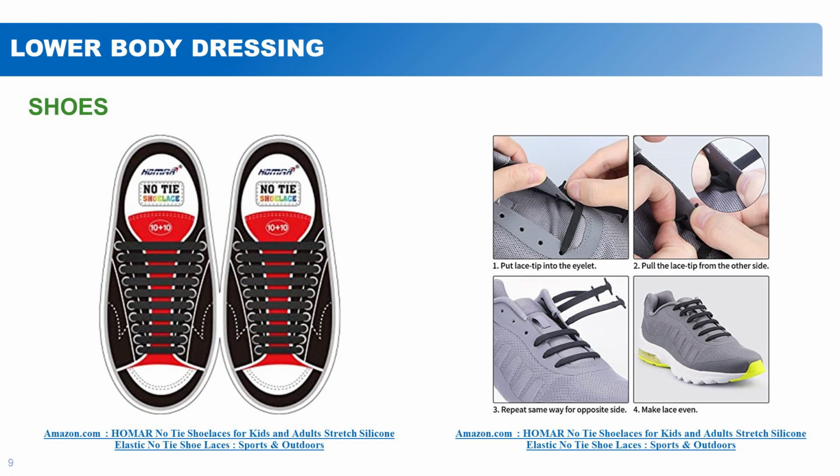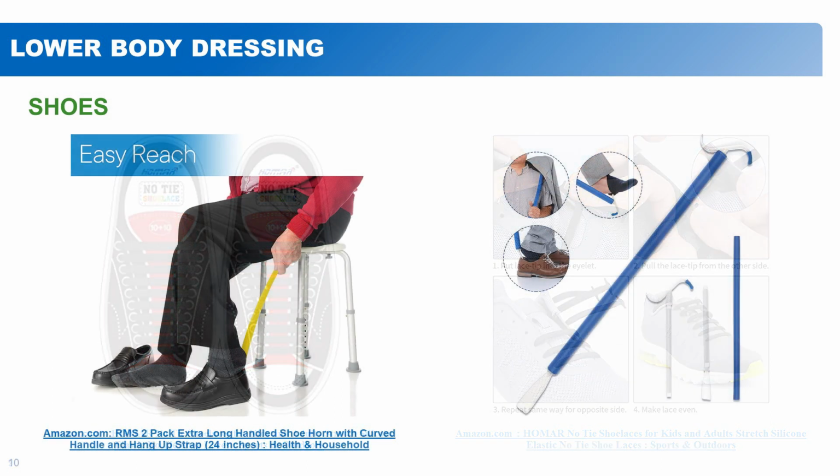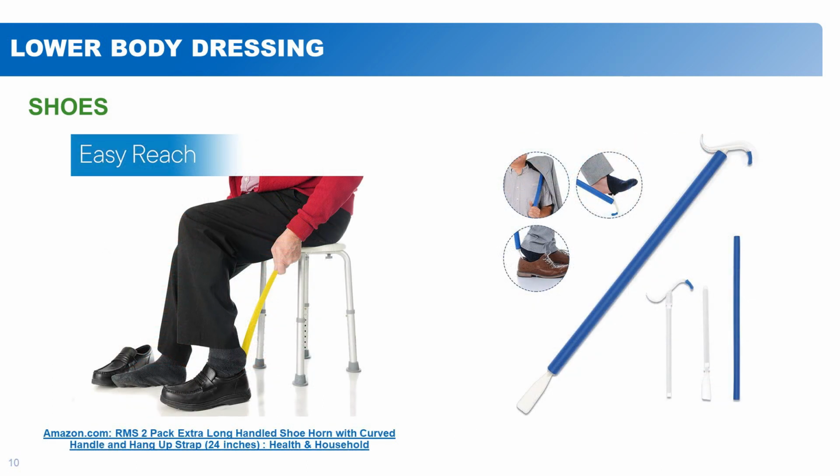Next, you'll see some elastic laces that can be placed in your tennis shoes as well. These are graded in size so that closer to your toes is more narrow, closer to your ankle is more wide, and so it makes it easier for you to slide your foot inside of the shoe. You can use other devices, including a long-handled shoe horn or a dress easy that's pictured here, to help you slide your foot into the shoe.